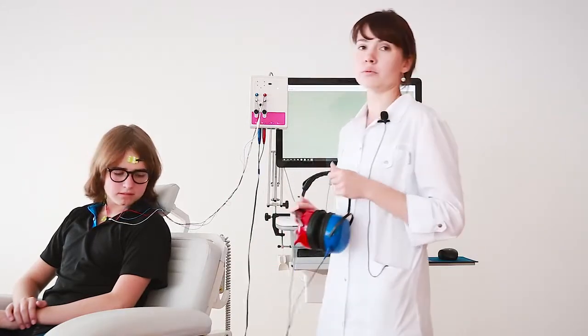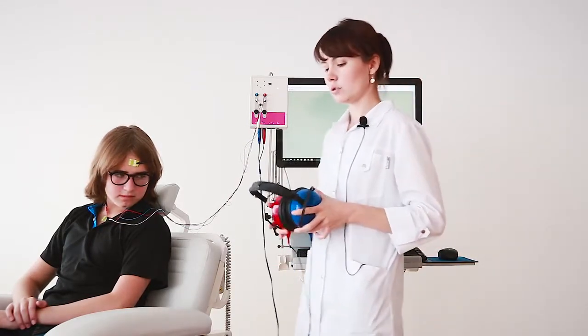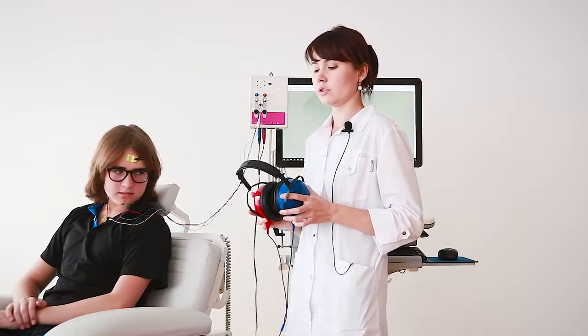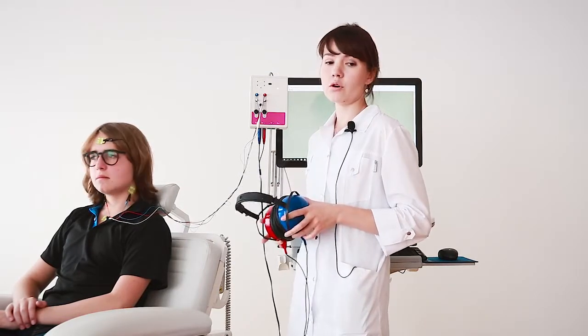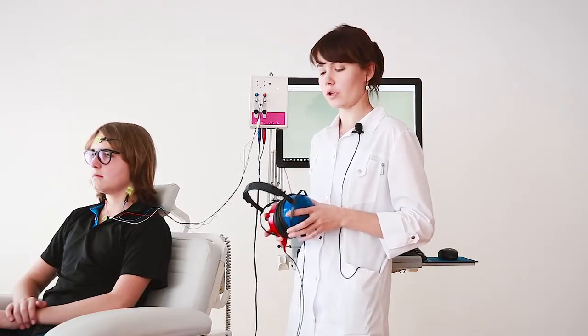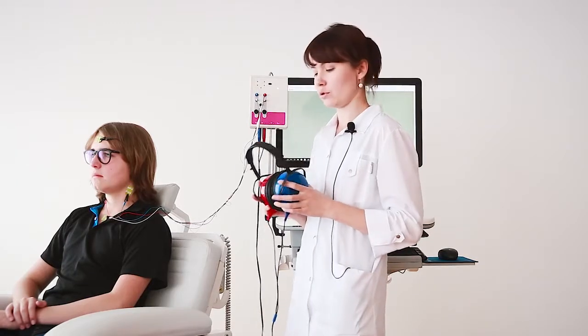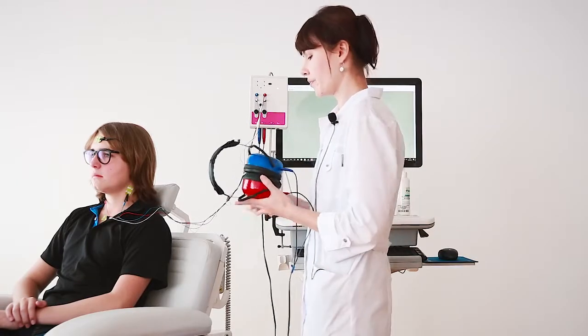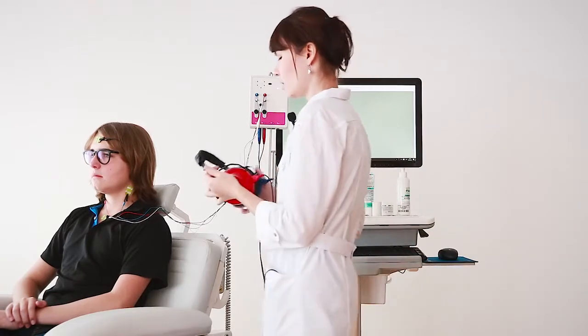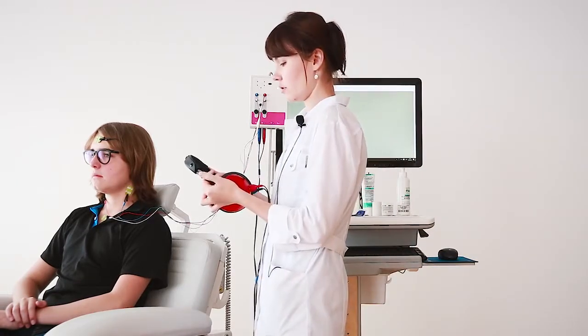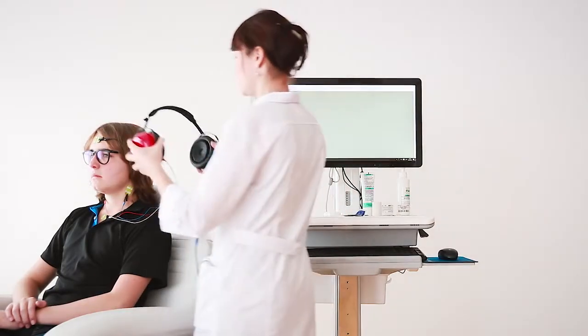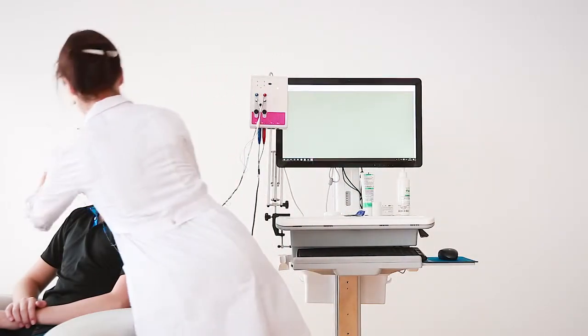As the stimulator in this test, we can use headphones or insert headphones. Today we will use headphones. They are sound isolated and we can regulate the size.